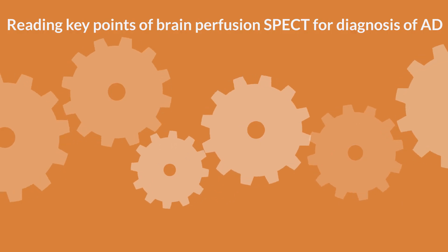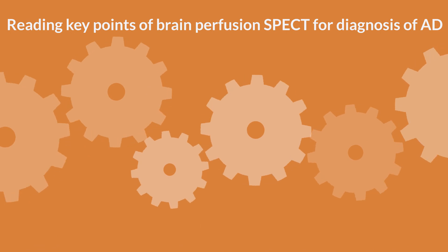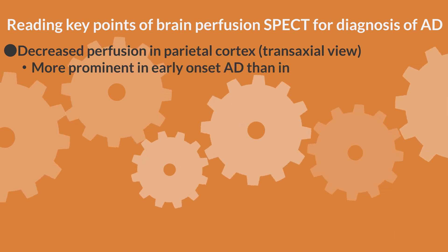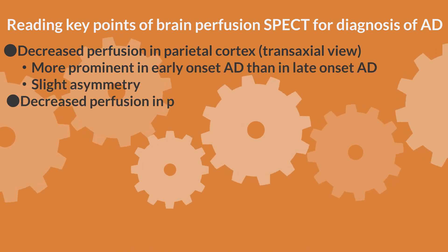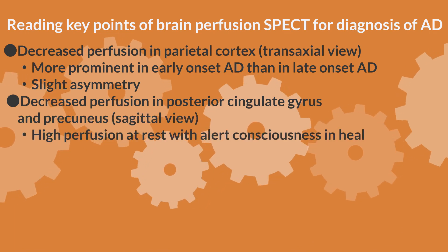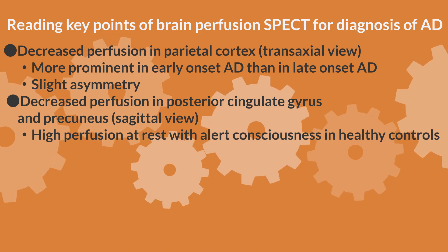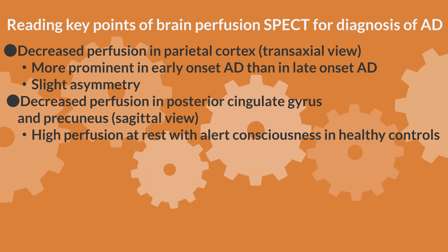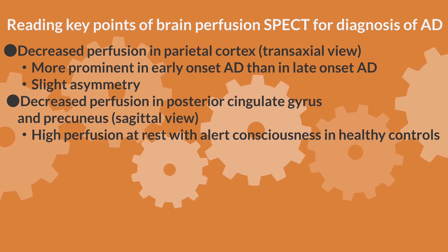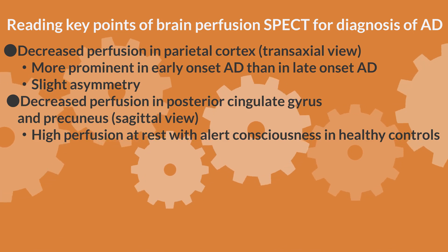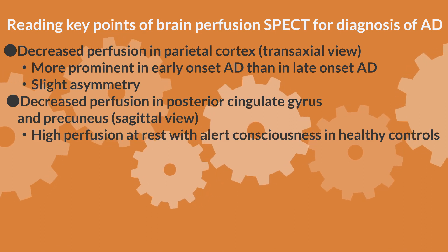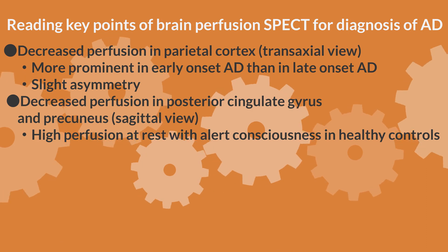The following is an explanation of the key points of brain perfusion SPECT reading in Alzheimer's disease. First, transaxial images should be taken to determine if there is a decrease in perfusion in the parietal lobe. This is more pronounced in early onset cases than in late onset cases, and mild left-right differences can be seen. Next, look for decreased perfusion in the posterior cingulate gyrus and precuneus, determined by sagittal sections. Since perfusion in this region is high when the patient is awake and resting, it is difficult to determine a mild decrease by visual evaluation; statistical image analysis methods can be helpful.